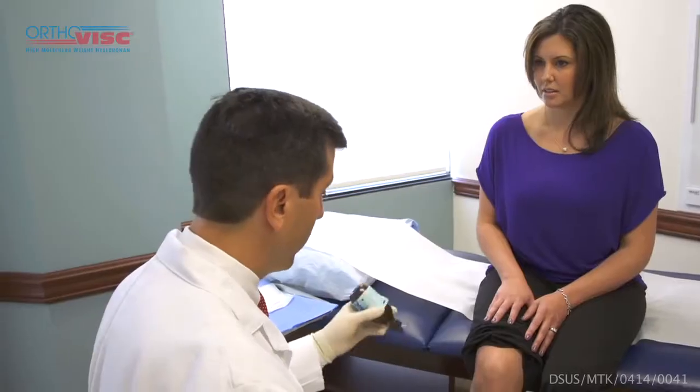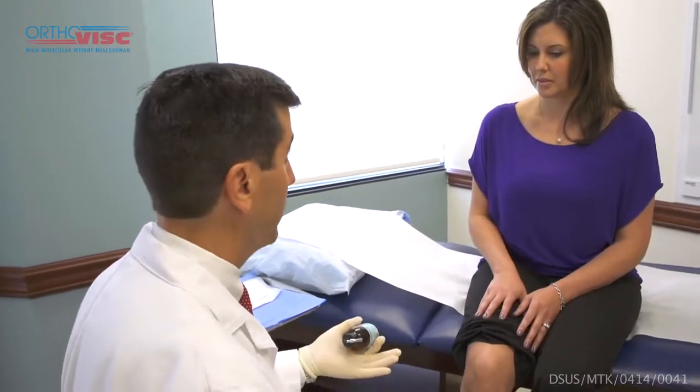While I'm getting the injection ready, I will use a topical numbing agent. Different providers do different things — some will do a little local injection of the knee first. I prefer to use the topical refrigerant, which is a very cold spray. I'll spray it on for a couple of seconds and then do the needle injection itself.